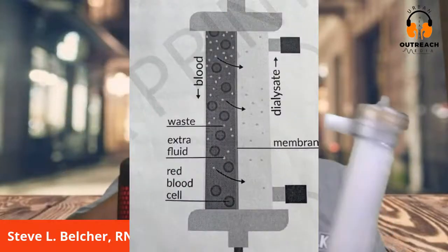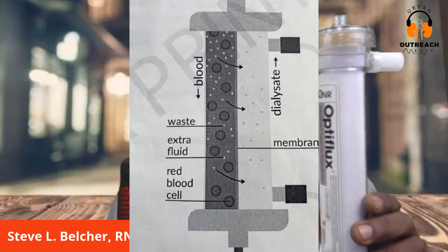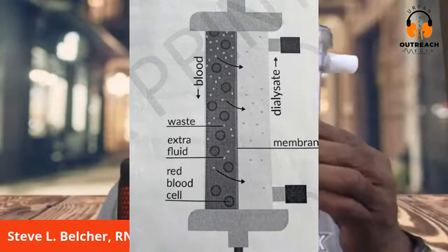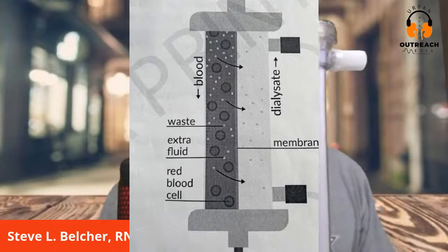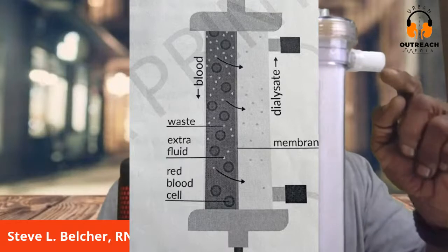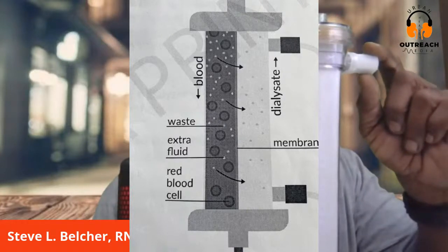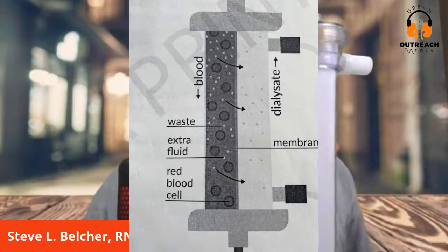But the dialyzer acts as the artificial kidney, your kidney. And this is where the magic happens. What I mean by where the magic happens, I have a picture so I can help you understand. So if you look at that picture, all right, I'm trying to get it so you can see that. Now you see where it says blood and dialysate. Here at the top is where the used fluid goes, when people ask where the fluid goes. It's connected to the dialysate hose.